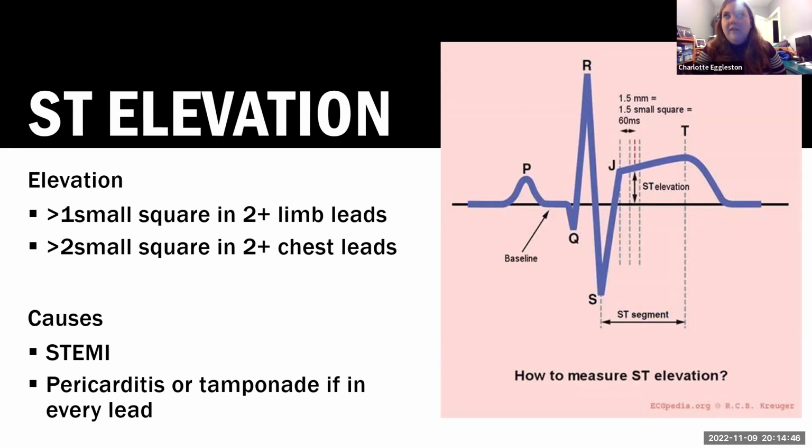So if you get a question that's a 30-year-old with a recent cold who has an ECG and there's ST elevation everywhere, it's probably pericarditis rather than them having a massive STEMI. But we'll have a look at some examples.